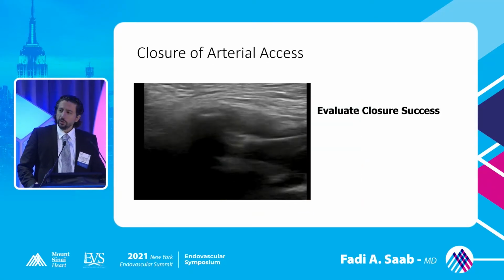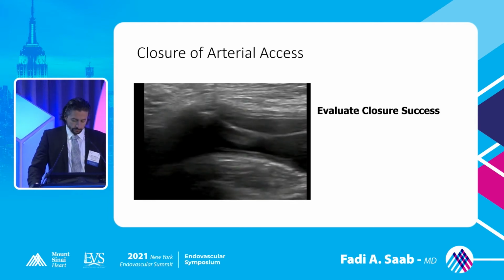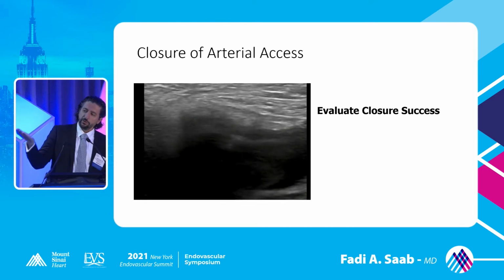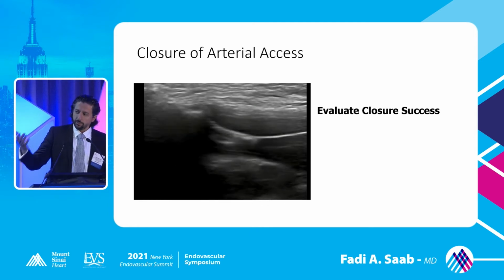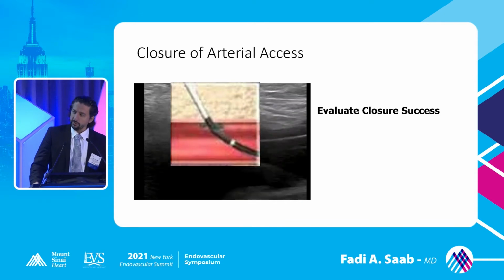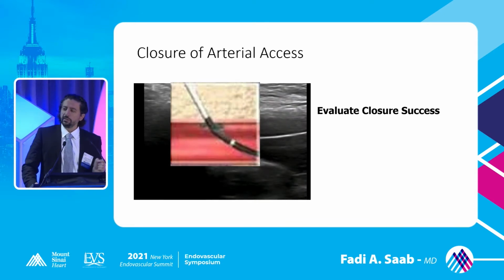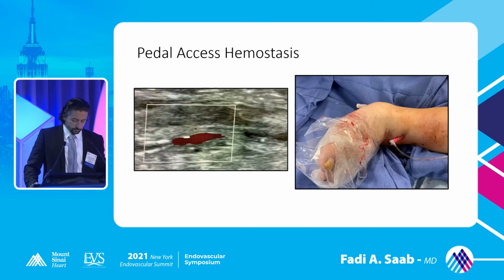How about closure? This is a Perclose closure device in an antegrade fashion. We're deploying the foot plate of a Perclose closure device against the anterior wall of the vessel. I am comfortable that my device is there. I'm not puncturing a plaque. I'm not puncturing the posterior wall. I'm comfortable deploying the Perclose closure device there and not having a complication for the patient. None of our patients leaves the table without scanning their groin before they leave the cath lab.